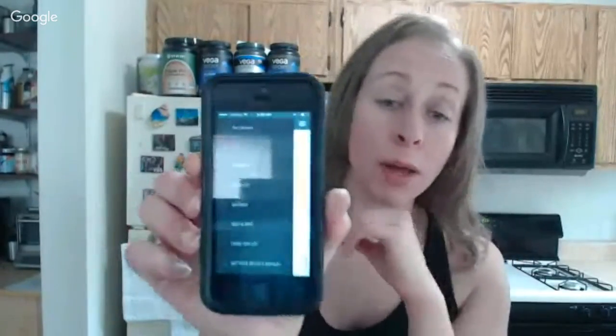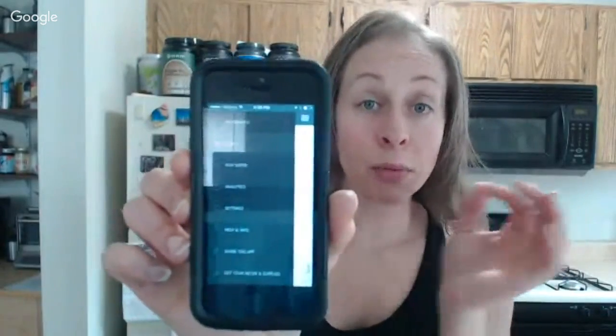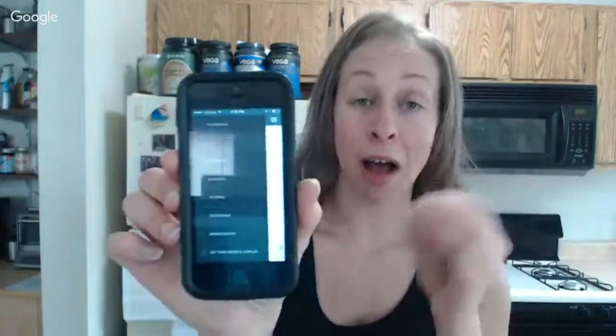You set up your own diabetes profile in the menu. I'm not going to go through all the stuff in the menu, but there's analytics, meaning you can see every blood sugar that you've taken in a chart on a graph, days, times. The thing that I do love is the statistics, I think. No, wait, that's the wrong one. It's the logbook and charts.